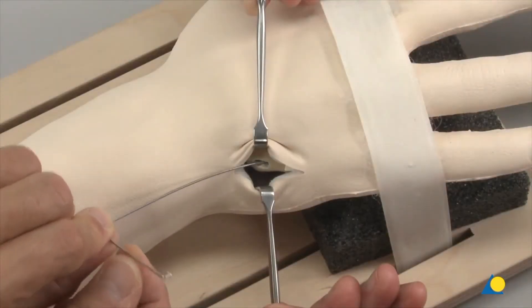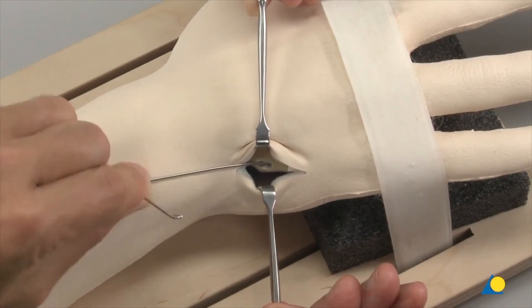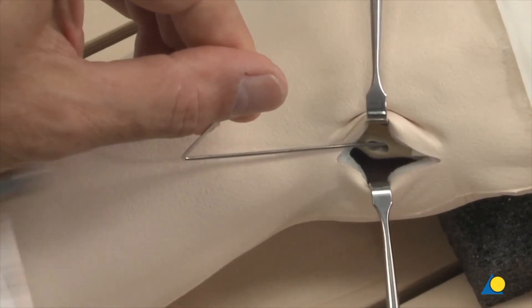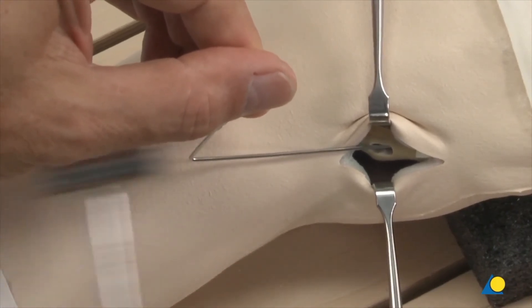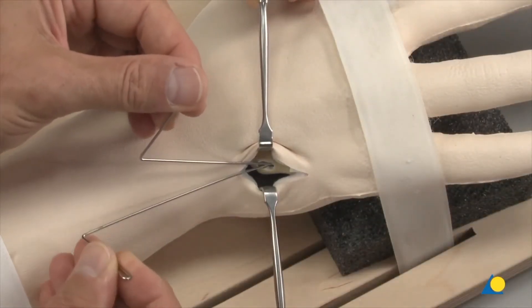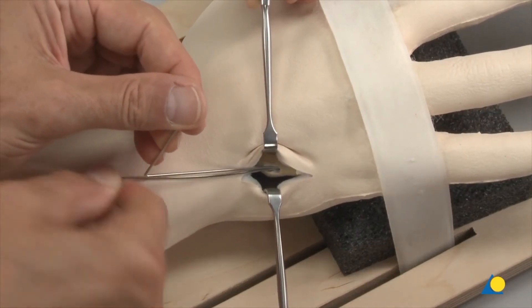Prepared in this way, the wire is pushed into the medullary canal by hand. If necessary, it is carefully driven in with the hammer in the distal direction. The second pre-bent K-wire is inserted in the same way. The K-wires are advanced distally to the level of the fracture.